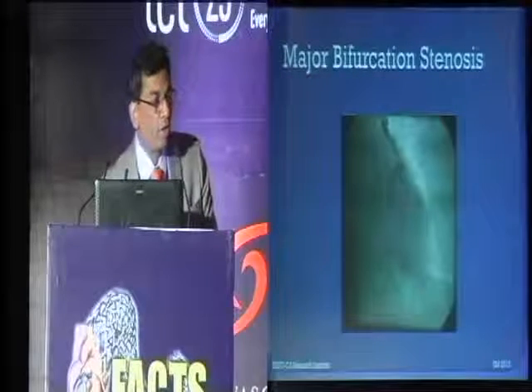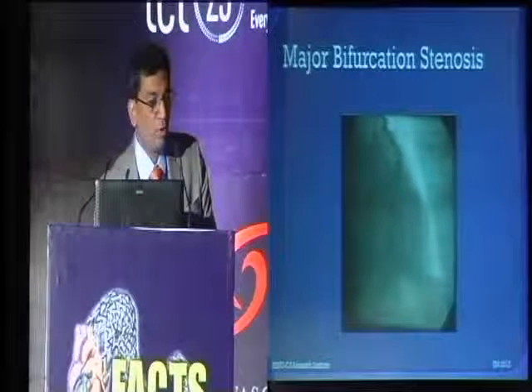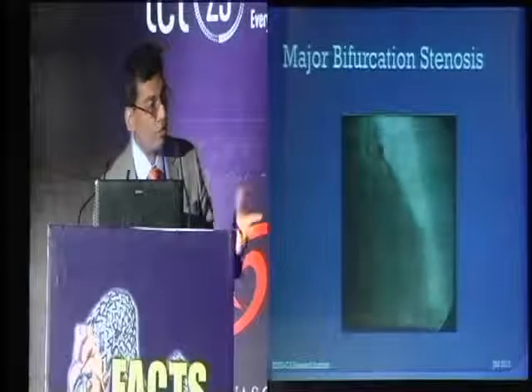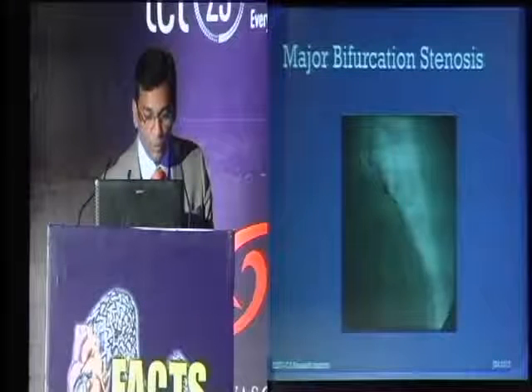This is a LIMA to the LAD. This is what I mean by diabetic vessels. Even though the LIMA is open, the distal LAD is pretty diffusely diseased. This is typical diabetic vasculopathy, which is why stents don't work that well in these cases.